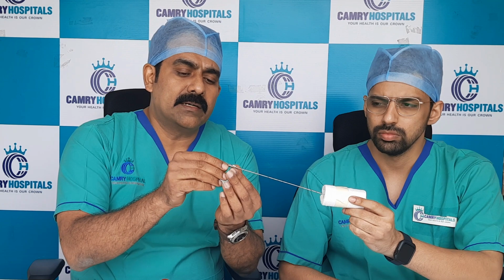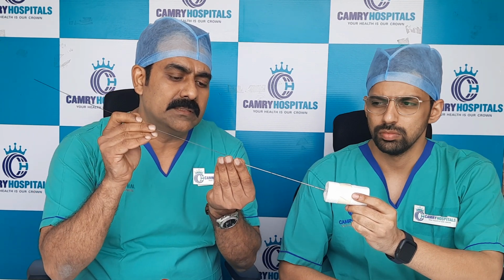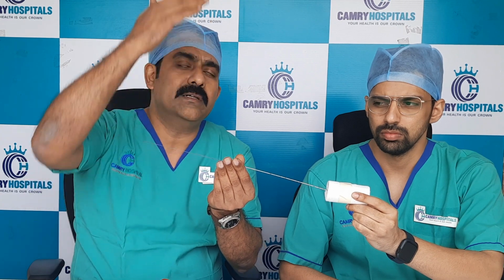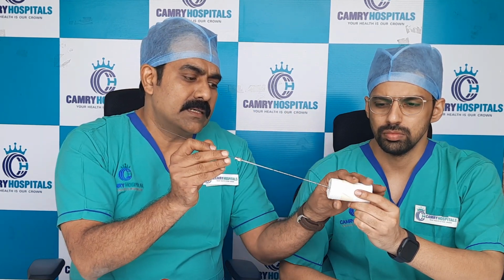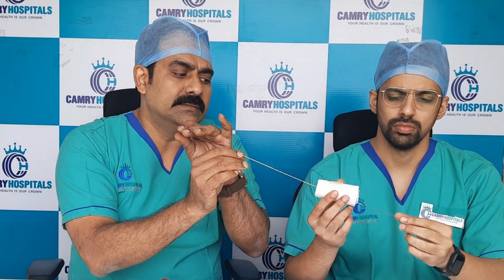We will remove the stylet. Then the guide wire, this is a 1 mm guide wire, goes inside the needle. Then I will check the position with the computerized image intensifier. So we will know the position in the disc and decide. Once the guide wire is inside, we will take out the needle. Then we will have a dilator.